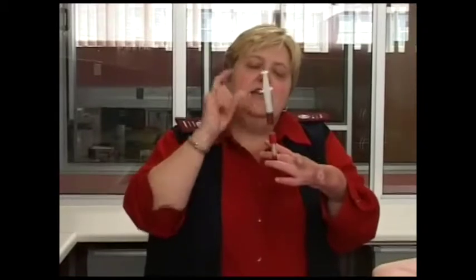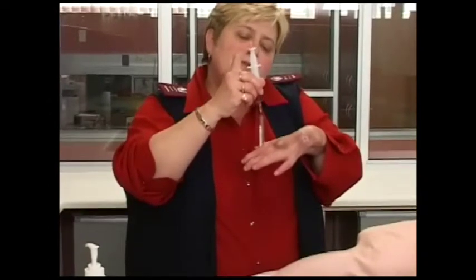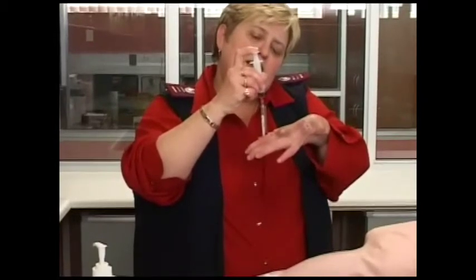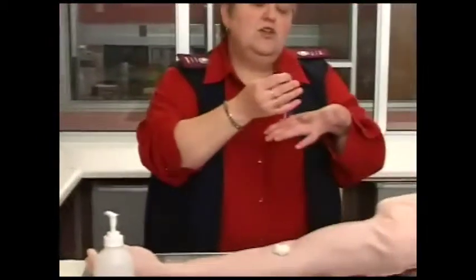If you have a lot of tubes and not that much blood, you need to open the tubes — always tilt it — then insert the blood in there. When you do this, it must not go in very fast; it must go in slowly because you don't want to hemolyze the blood. It must be a slow movement, then discard the needle in your waste bin and close your tube.